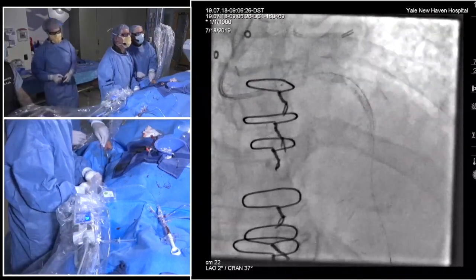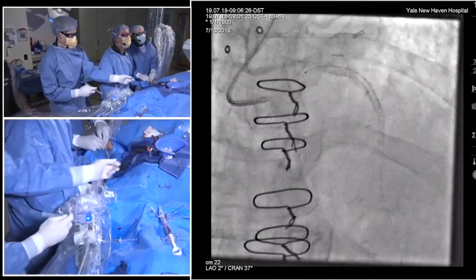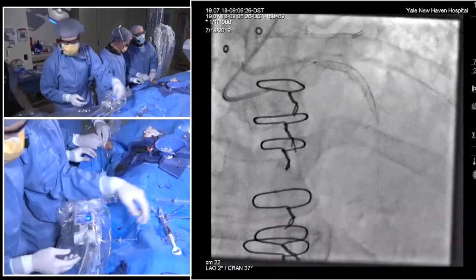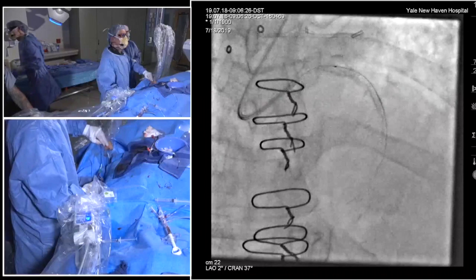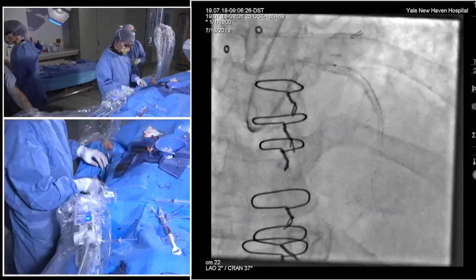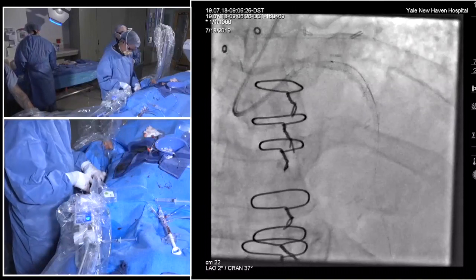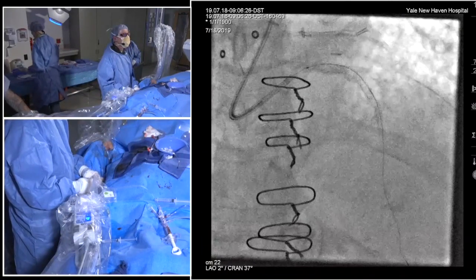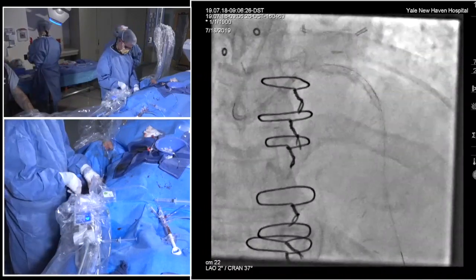So the idea here is you try a little bit, and if the IVUS doesn't cross easily, you just take it out and then post-dilate, because if it's catching on the edge of that stent and you push, you can completely compress the stent and have all kinds of misery after that. So yeah, I would just post-dilate. There are times to push harder, and times when that axial pushing strength is telling you to stop pushing. Especially after all the work that you've done, you don't want to screw up at the last second.